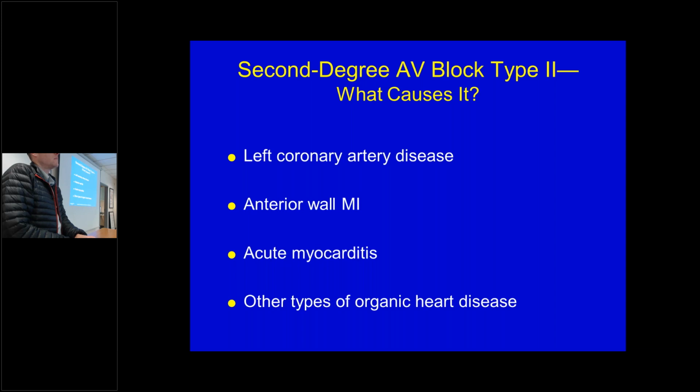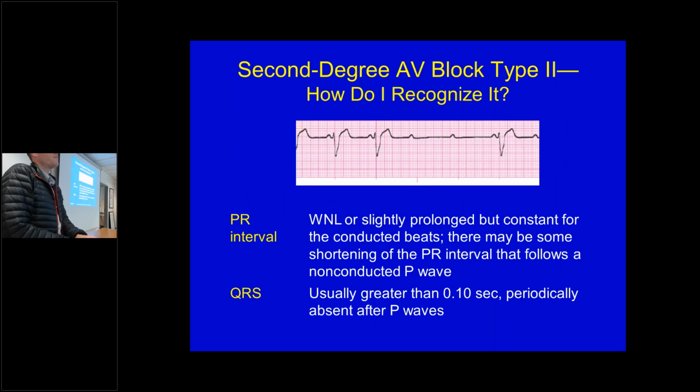I guess I don't really see the difference in those two that they've showed us. How it's the difference between above or below the node. Why does that tell me that that's subnodal? Because you have a wide QRS. And because the PRI is relatively normal. So everything's going on, the conduction system looks pretty good through the atria. And when it gets past the atria and starts to get towards the ventricles, that's when your conduction system is bad and becomes delayed, with that wide QRS.